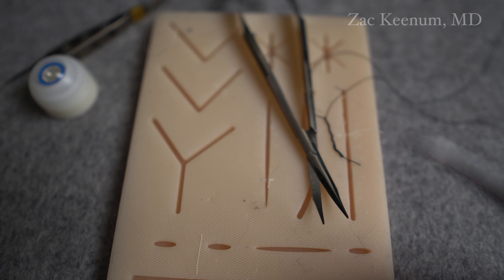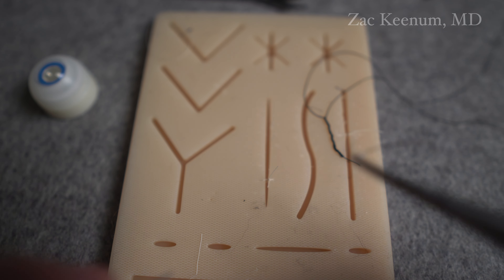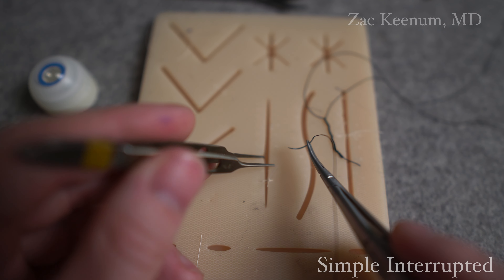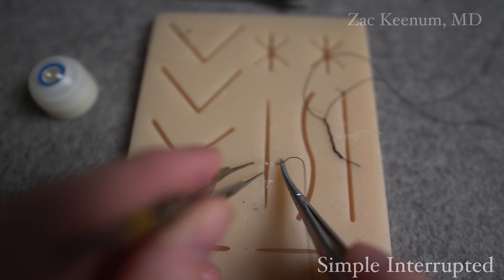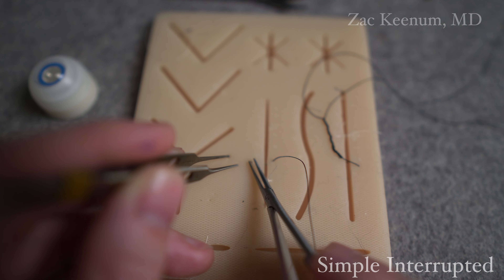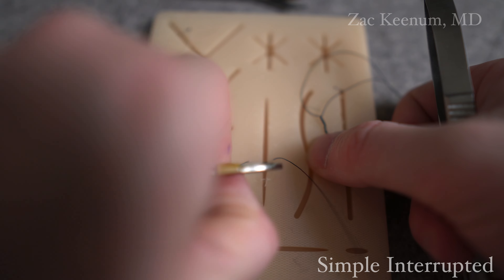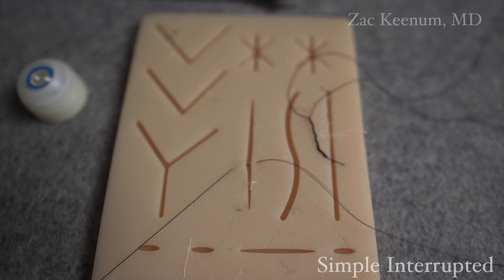So let's get into the suture technique. I'm going to start by loading it for forehand. Let's do a simple interrupted suture here. What I'm going to do is grab the skin edge like so. I'm going to pass from one side. I don't have to unload the needle. I can pass through to the other side, trying to match the height and the depth in my incision. Let's pull the needle through and we're going to tie with a 2-1-1 knot.